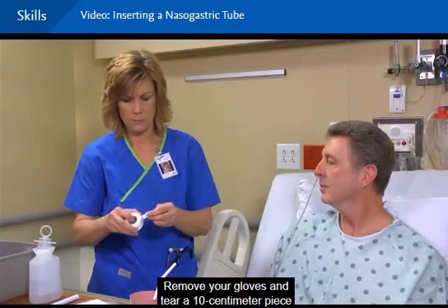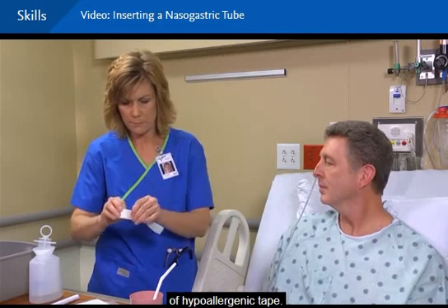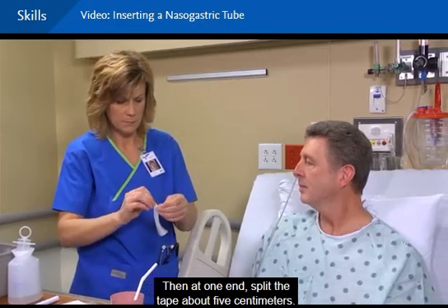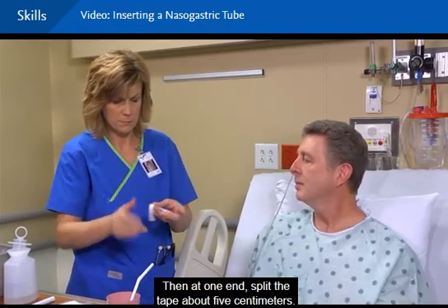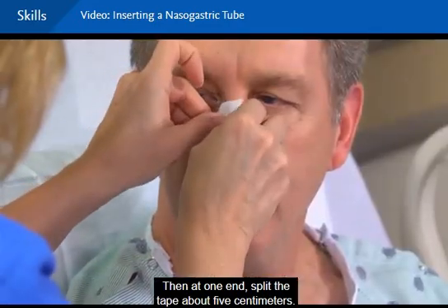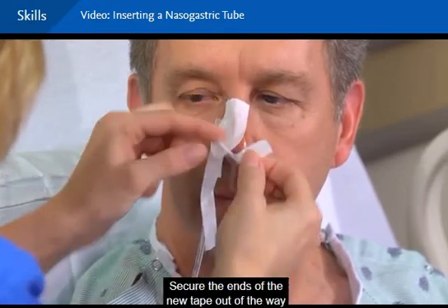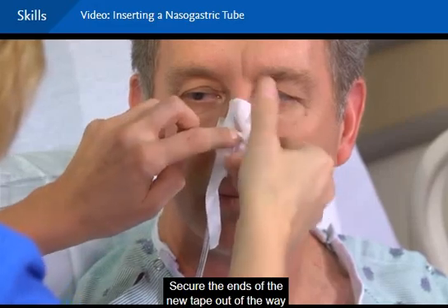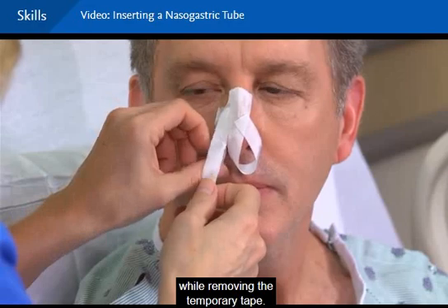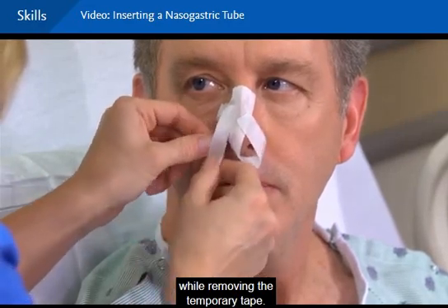Remove your gloves and tear a 10-centimeter piece of hypoallergenic tape. Then at one end, split the tape about 5 centimeters. I'm going to place it on the bridge of your nose now. Place the intact end of the tape over the bridge of the patient's nose. Secure the ends of the new tape out of the way while removing the temporary tape. Carefully take this old one off.